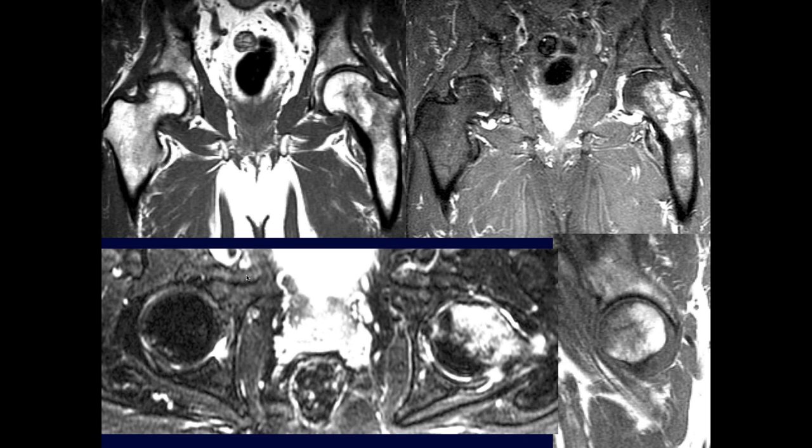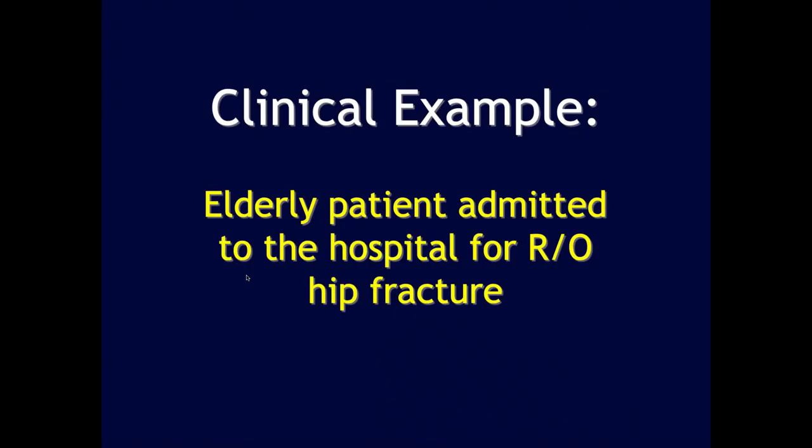It just shows edema within the neck. We're seeing a lot of these. This is the patient that we saw very early on, actually, in Santa Barbara. So this is an elderly patient, came into the hospital, and it was for a rule out hip fracture.